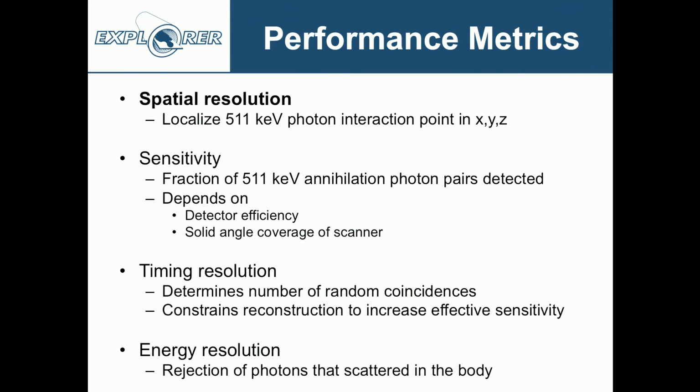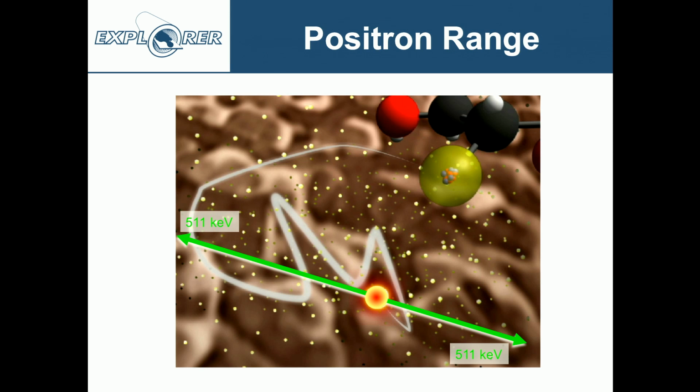So let's talk for a moment about spatial resolution first. What spatial resolution can we ultimately hope to be able to obtain for whole body human imaging?